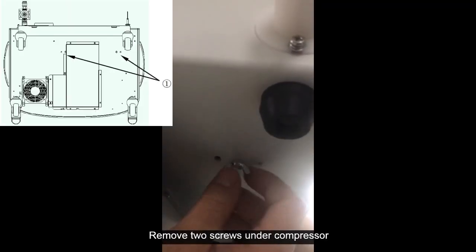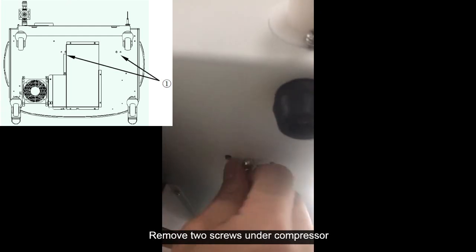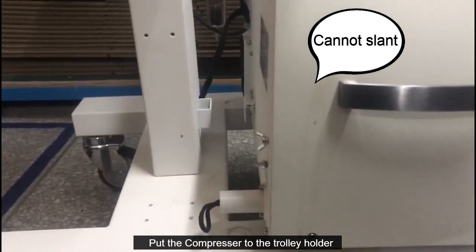Remove two screws under the compressor. Then put the compressor onto the trolley holder.